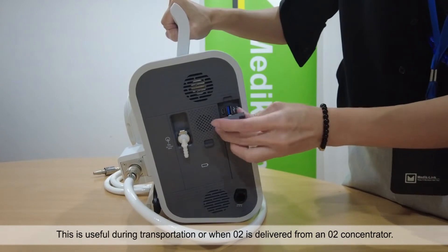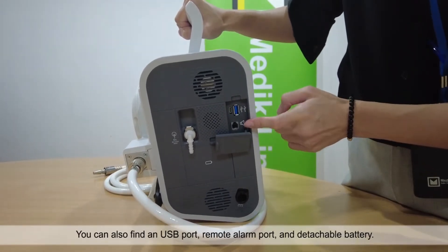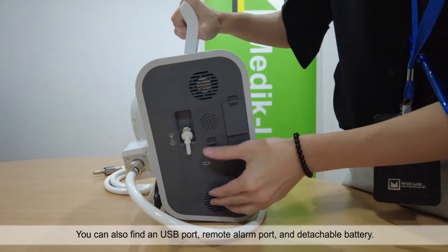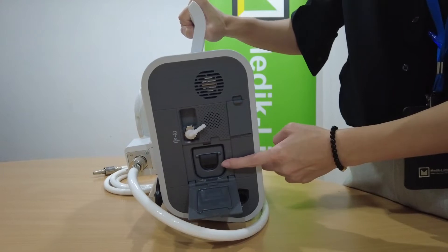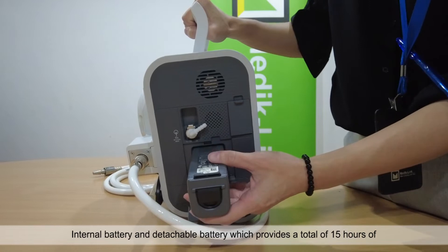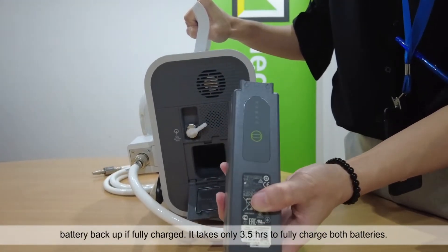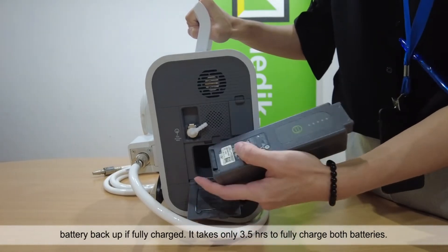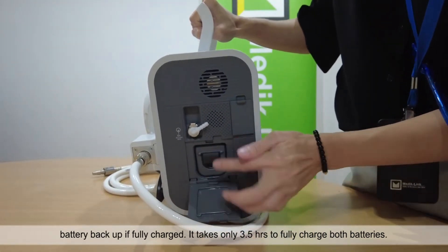This is useful during transportation or when O2 is delivered from an O2 concentrator. You can also find a USB port, remote alarm port and detachable battery. This ventilator comes with two batteries — an internal battery and a detachable battery — which provides a total of 15 hours of battery backup if fully charged. It takes only three and a half hours to fully charge both batteries.